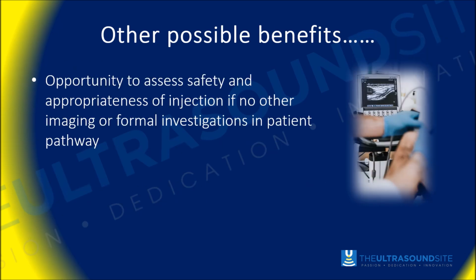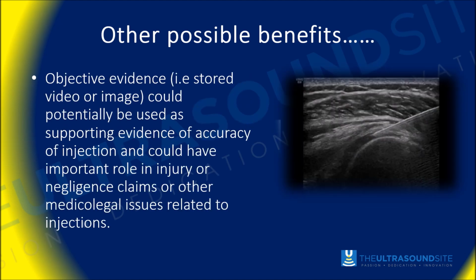Other possible benefits are to assess the safety and appropriateness of the injection, as we said, particularly where there are no other formal investigations in that particular patient pathway, and allowing us to store objective evidence of exactly what was seen and where the needle was placed. This could be really important evidence in supporting the accuracy of the injection, and also that the injection was performed reasonably.